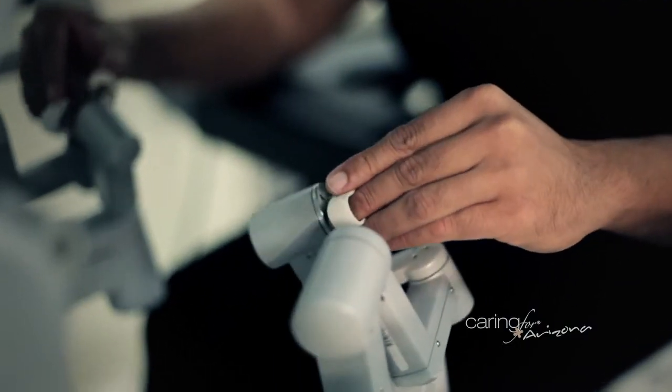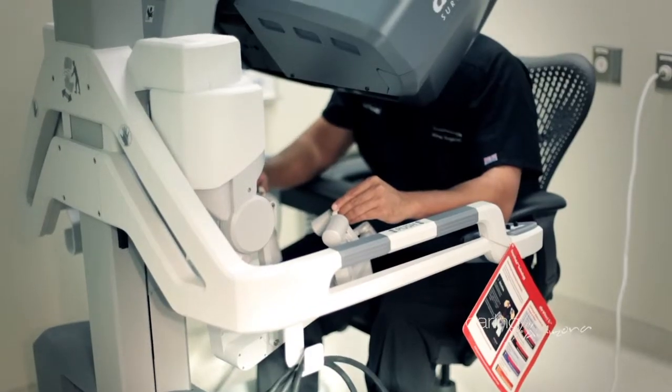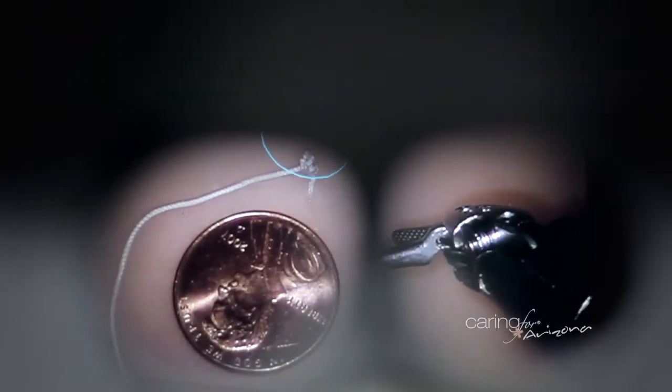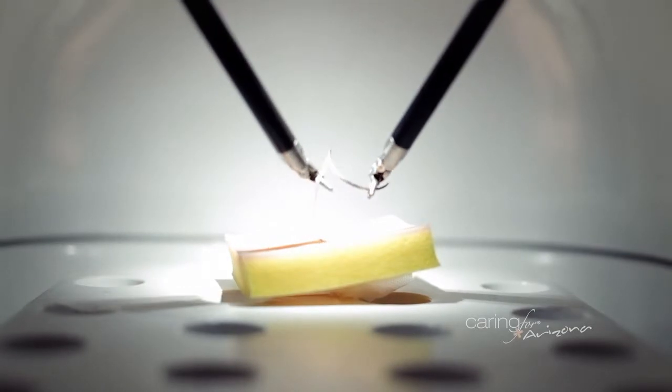Robotic surgery is a relatively new thing, and it's come on the scene in the last probably 5 to 10 years. The advantage to the robot compared to traditional laparoscopic surgery is the technological advancement. For example, you probably have a smartphone. A flip phone is a phone just the same as a smartphone is, but it doesn't work quite as well, and you can't imagine your life now without a smartphone. Just like technology is affecting things like cell phones and other areas of your life, it's affecting medicine too. For surgery specifically, the robot is a huge jump from laparoscopic surgery because we can see better, the camera optics are better, the computing power is better, and overall that translates to a better result in some cases.